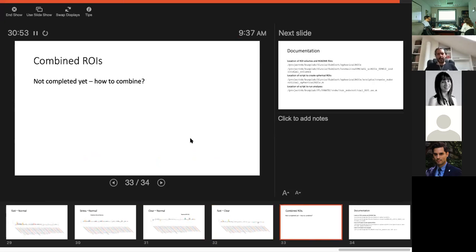We have the whole hierarchical approach for when we want to combine ROIs that we can use here as well, which is to first perform the analysis on combined larger groups of ROIs, and then for those results where we find significance within those larger groups, we look closer and try to break it down into smaller subregions and figure out what is happening there. We could use something like that.